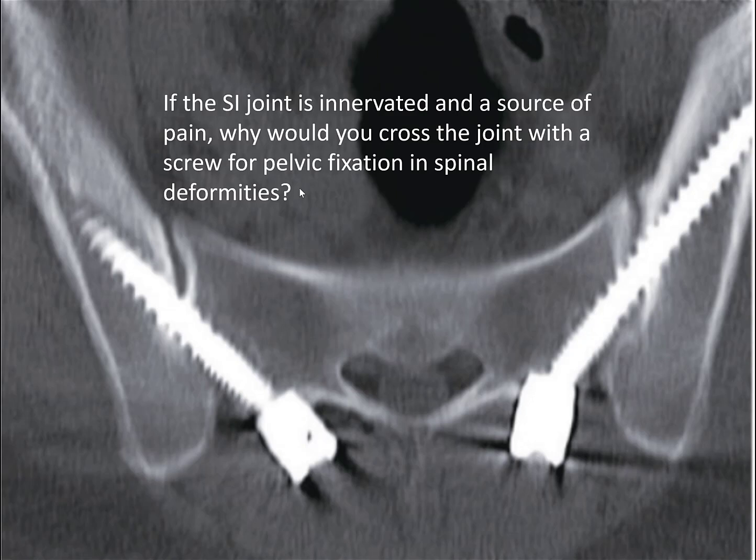You follow up a lumbar fusion for 5 years, let's say, and you put a screw in like this. Do you see lucency around the screw? Occasionally. And I've had some patients where I thought they definitely had pain coming from the loosening there. Have you ever gone back and done a fusion there on those patients?